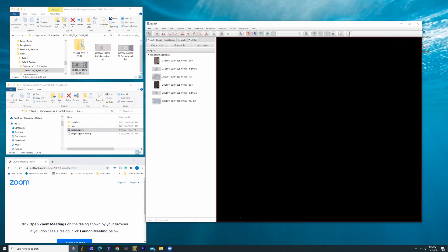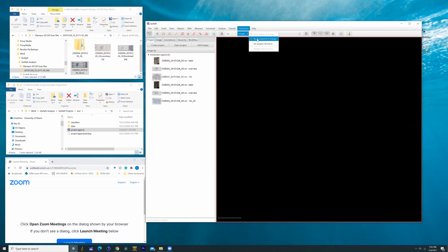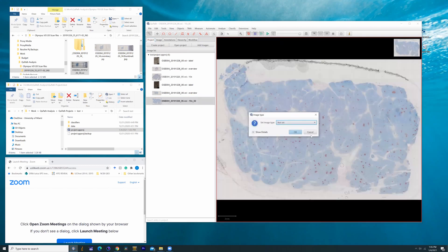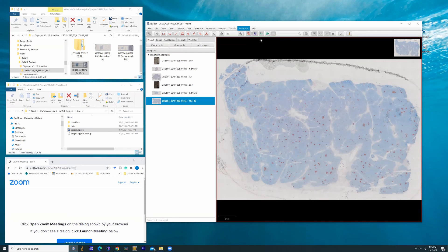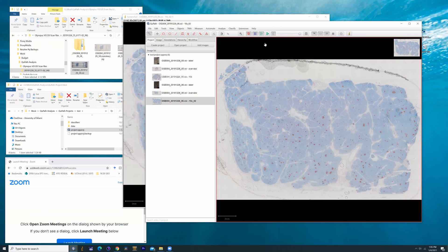If you just want it within ImageJ, play with a scaled-down version, you can go under Extensions. I'm going to click on image first. You go to ImageJ, Send Snapshots to ImageJ, and we can play with the image like a JPEG.